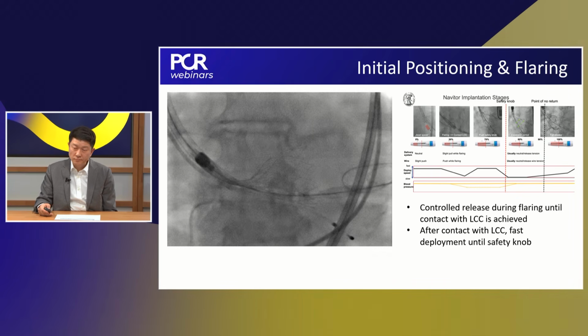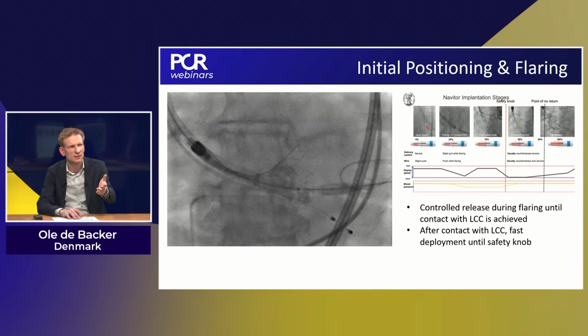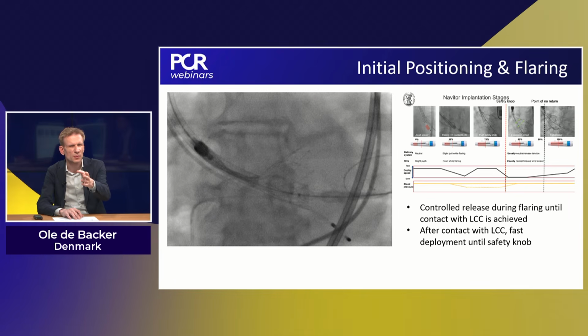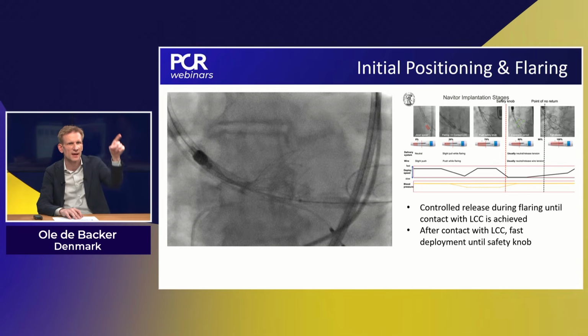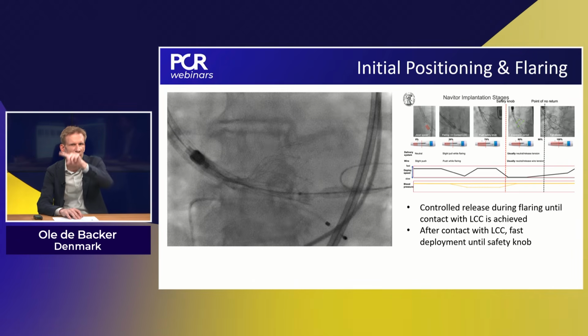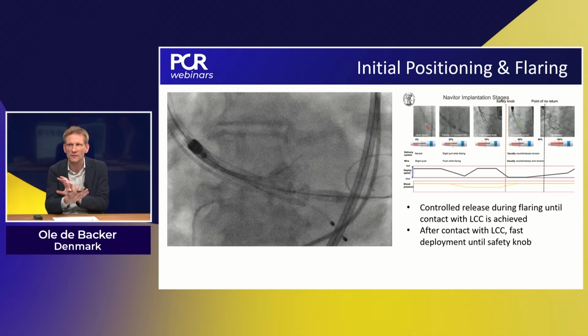Before proceeding here, look, do you remember, I think it's a case from a while ago, was this a tricuspid view or cusp overlap or LAO view? Because to me, this looks more like an LAO view, because you see the ascending and descending aorta like an arch that is opened. Yes, this is to me not a cusp overlap view.